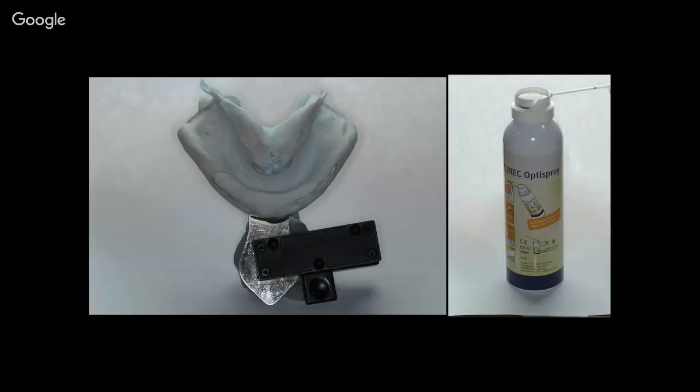And granted, there's not enough of these out there clinically for me to report back, but the ones I've assisted people on to this point, we've not seen any teeth pop out. So time's going to tell on that. If you went the route of printing the teeth, the printed material in white is essentially the same material as the pink. So you get an incredibly good bond between those. I think you have very, very little chance of those teeth debonding because, again, once they're bonded together, it almost becomes a monolithic piece of composite or acrylic or whatever you want to call it.